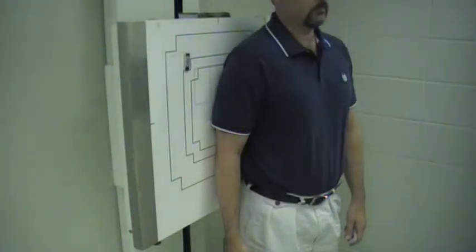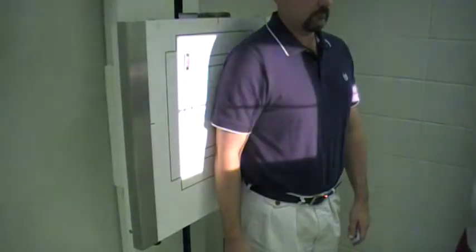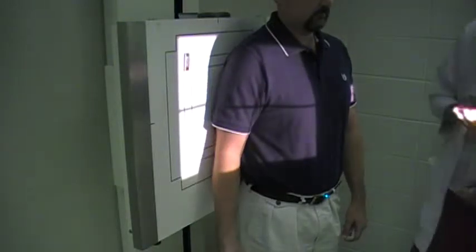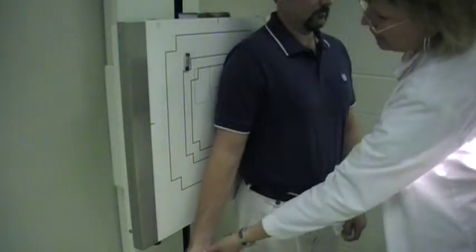We're doing imaging of the humerus in the upright position. You're going to have the patient position with the back up against the image receptor. For the AP projection, you're going to have the hand supinated.